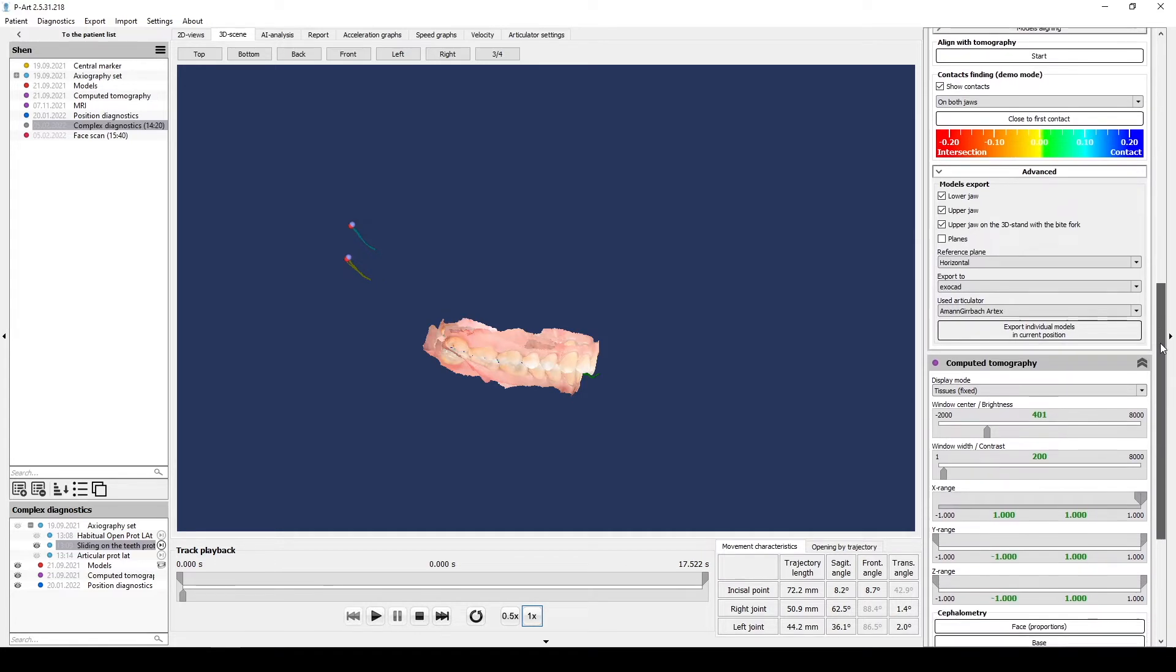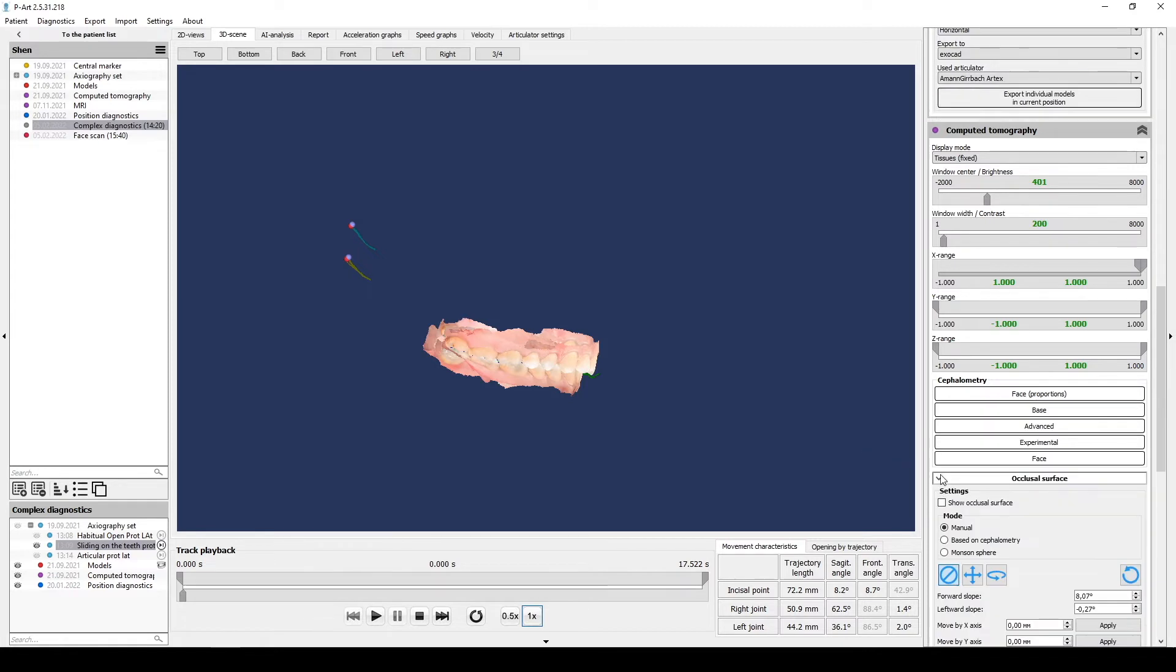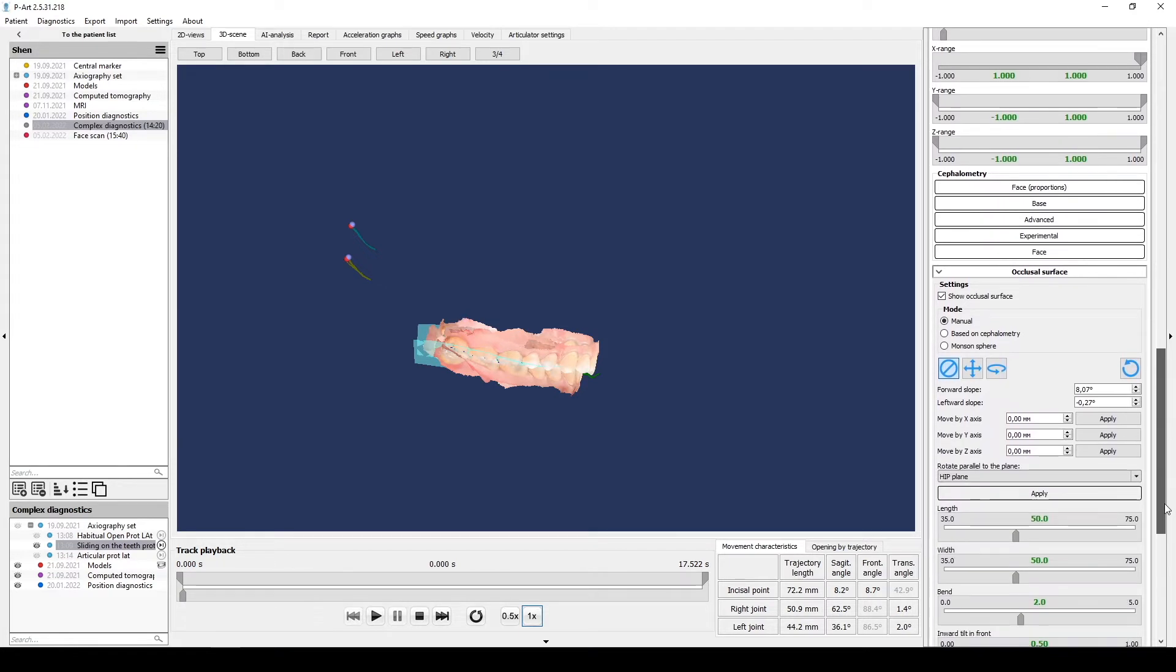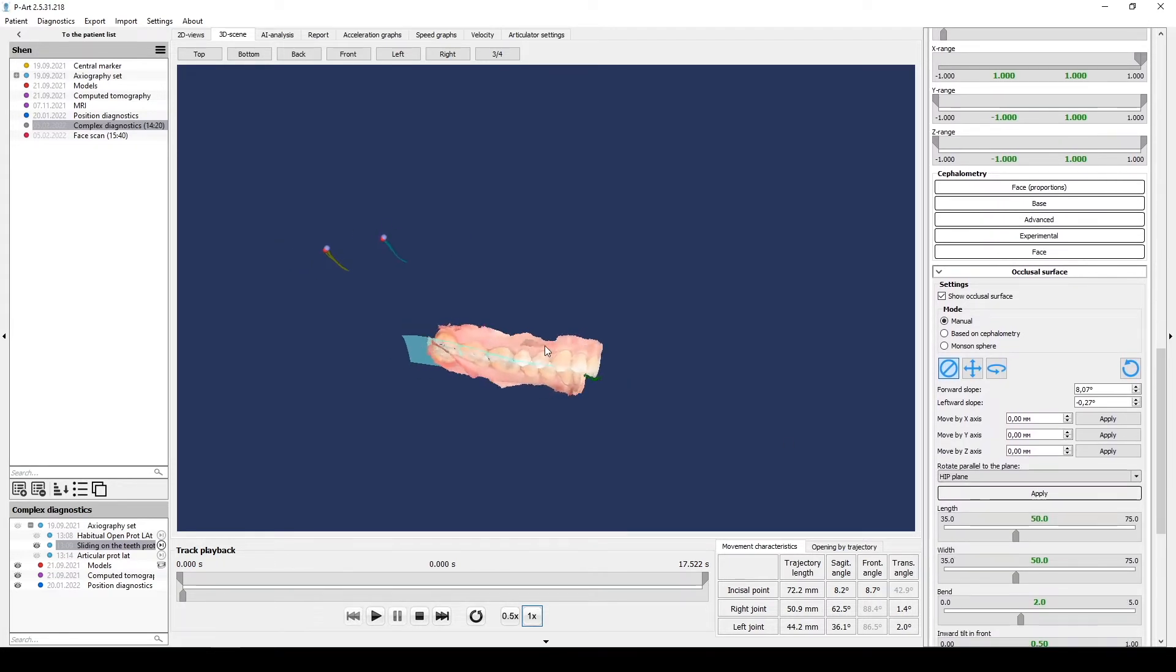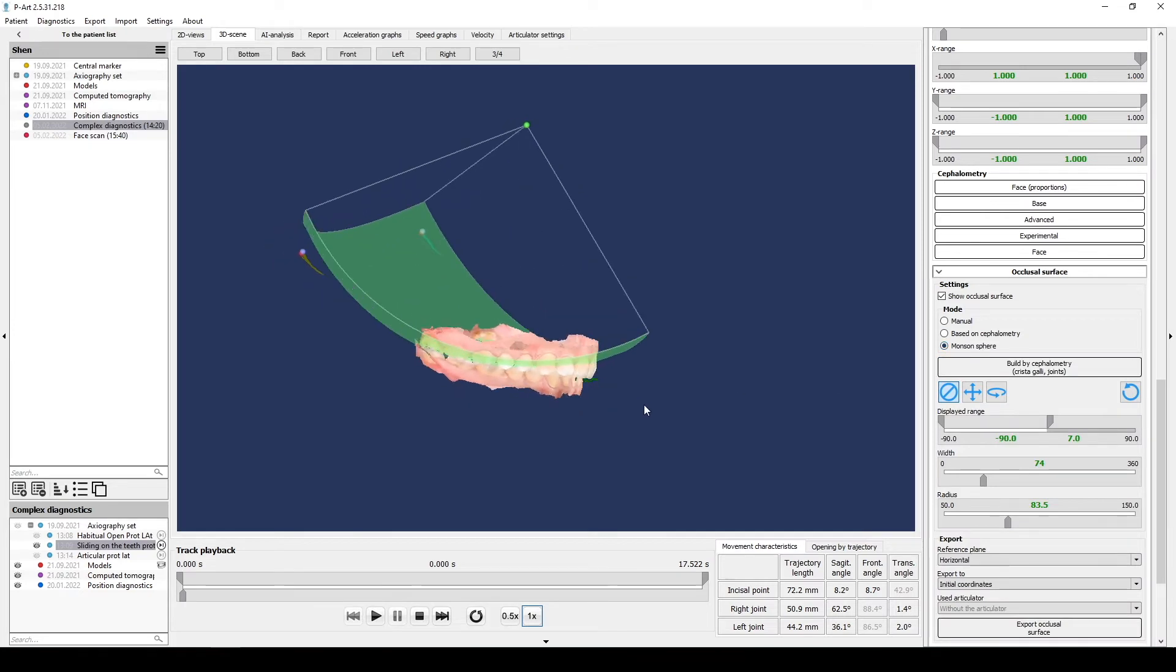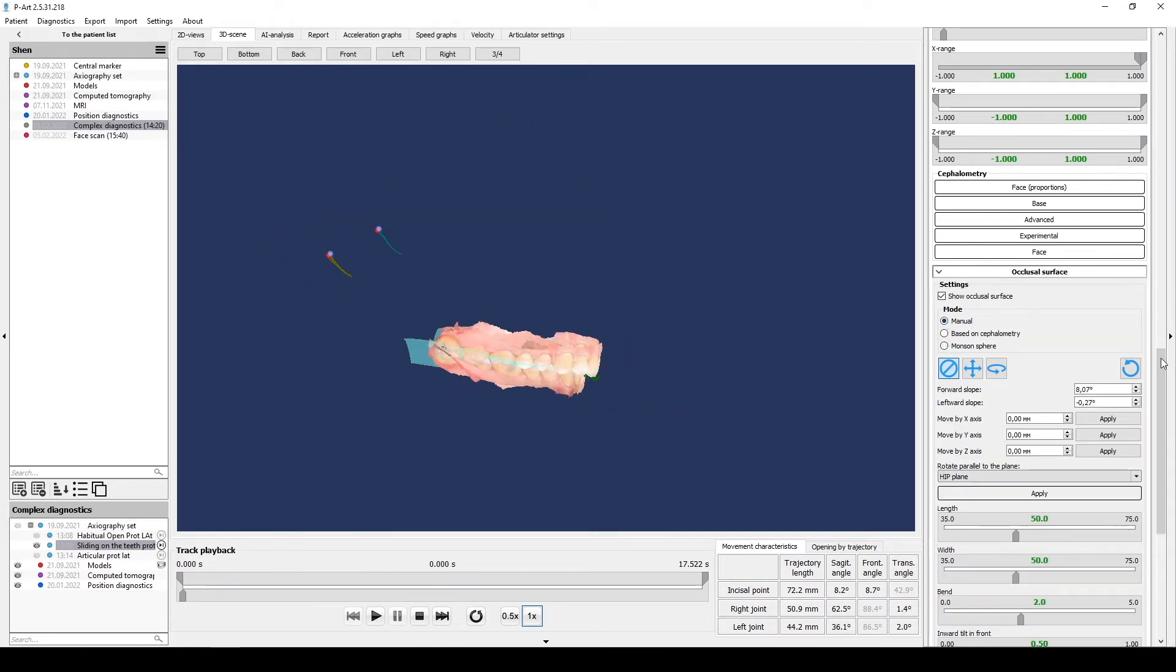Also you can export extra occlusal surface as an auxiliary 3D object. For that in the section Tomography, select subsection Occlusal surface, and select the necessary occlusal surface which you want to export.